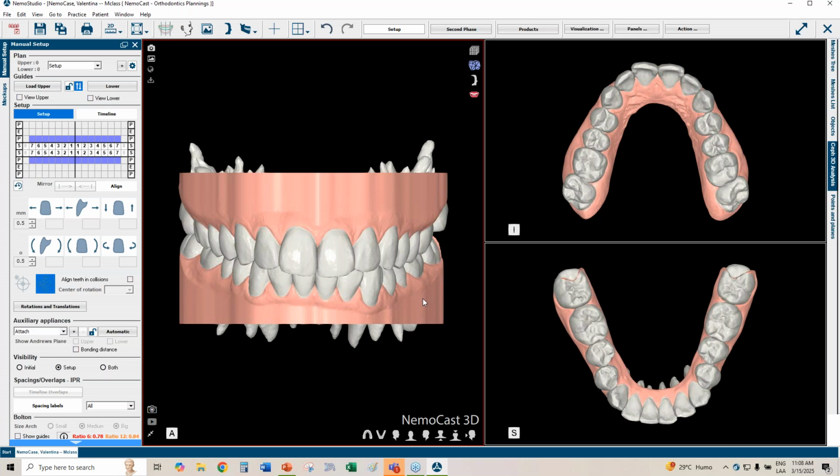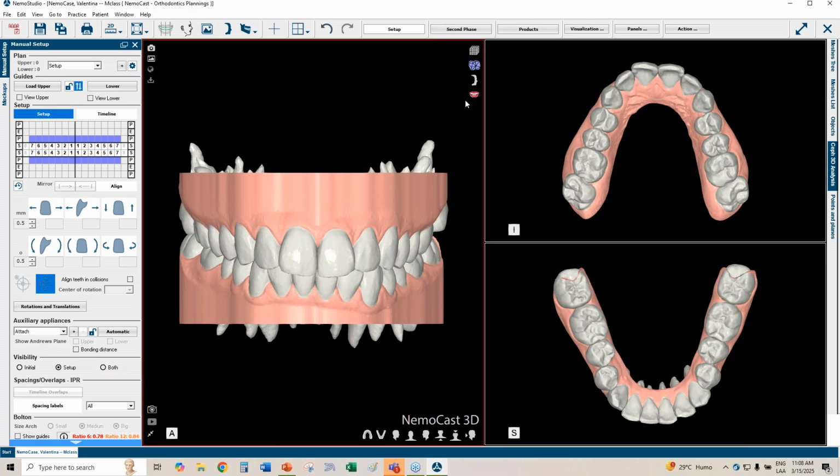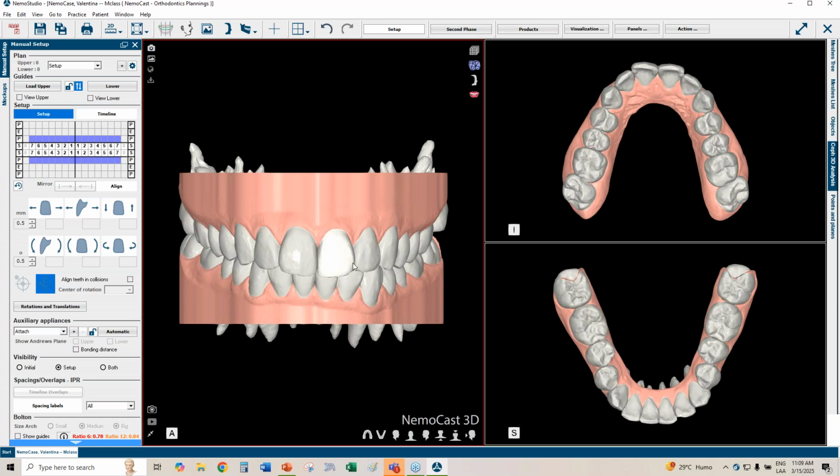Most of the time we tend to overlook some aspects of the normal orthodontic treatment, because we think that we will somehow manage to place aligners easier than doing a normal treatment. We tend to think of aligners as magical instruments.